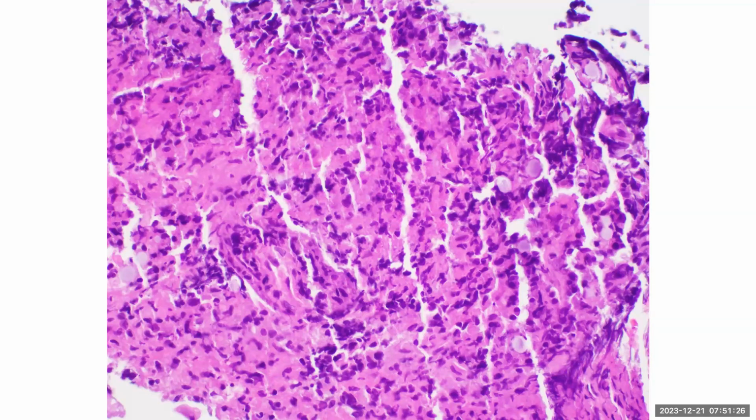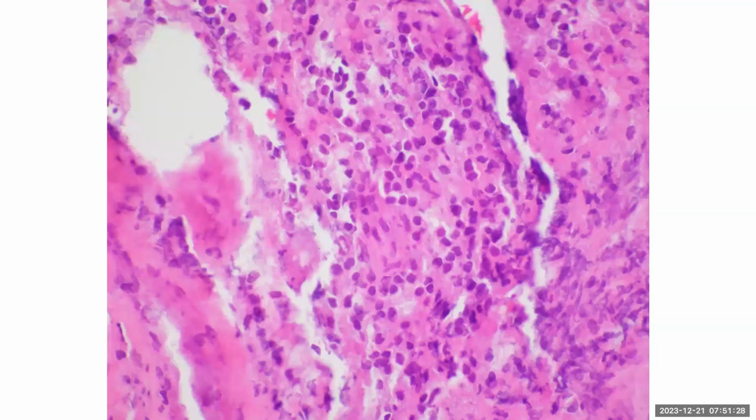Next. Another suboptimal picture here, but now you can see better the round, small cells that don't have visible cytoplasm or are very minimal, and this supports the lymphoproliferative suspicion that I had in the previous slide. Next.